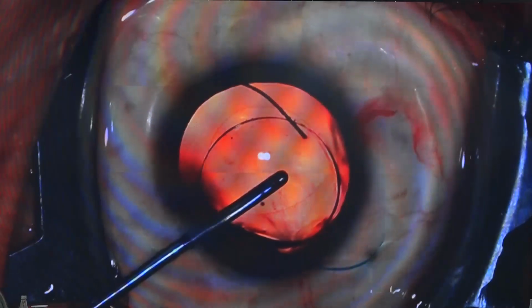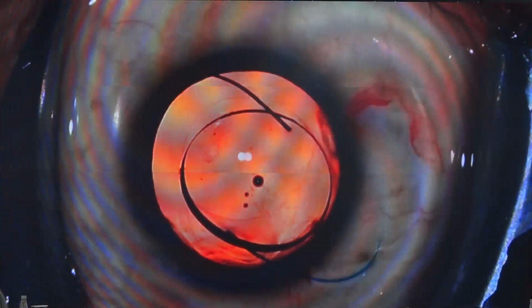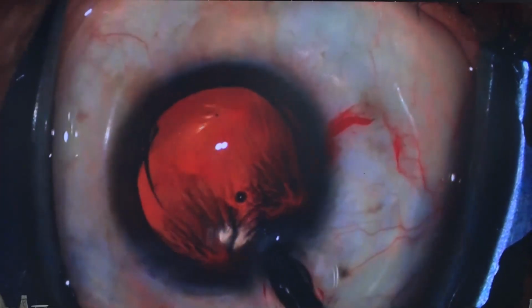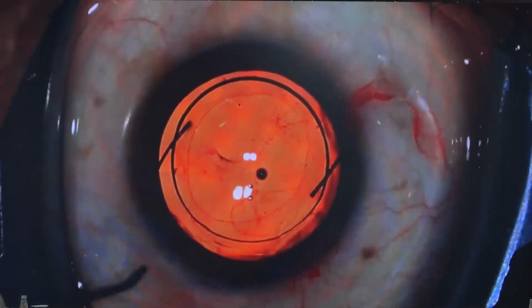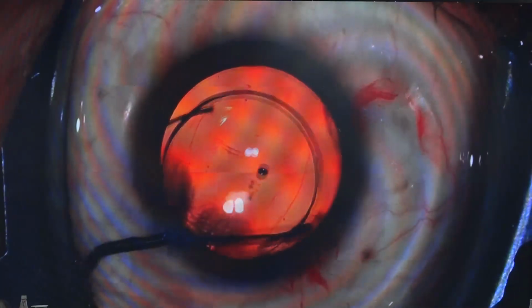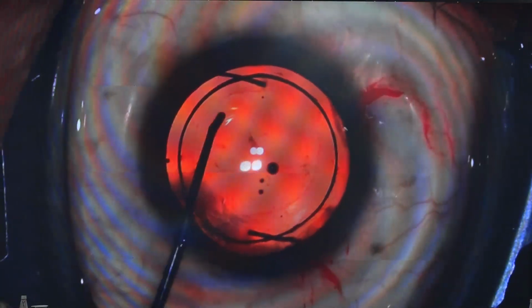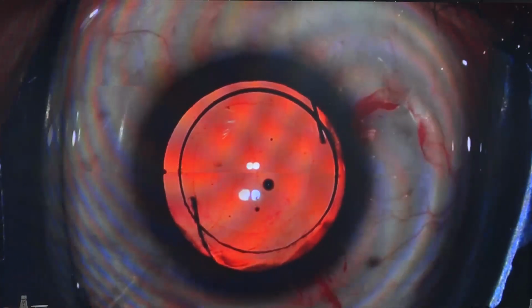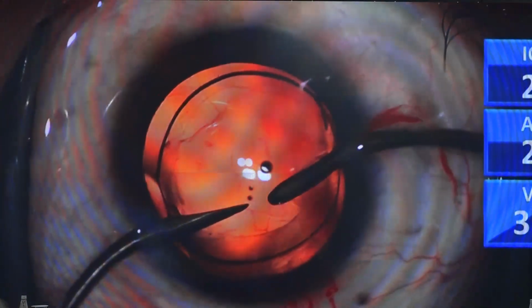Secondly, dialing such cases is a little difficult because of these memory-oriented haptics. So better nudge the IOL into the capsular bag. As you can see, the rhexis is well covering the IOL, and then I prefer the 3 and 9 o'clock position so that photopsias are minimized.